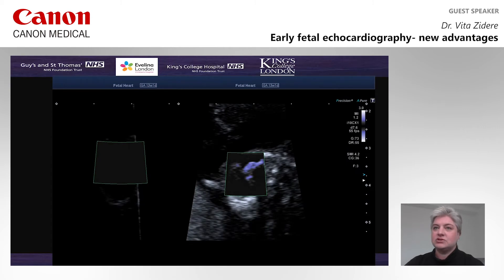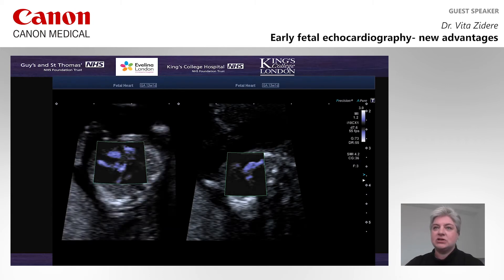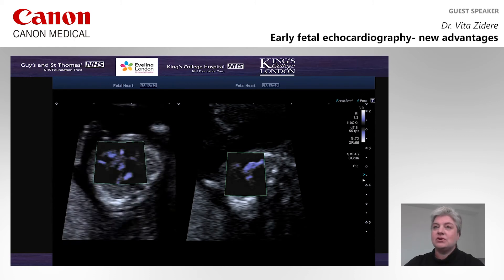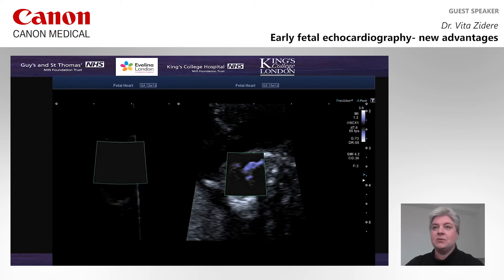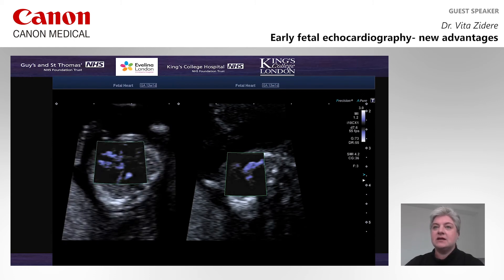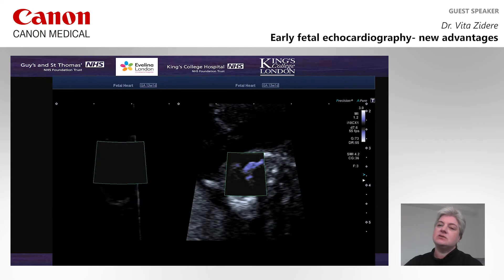We can now see the four-chamber view. Blood pool is highlighted within the ventricles and atriums. The interventricular septum is very well seen. We can also appreciate small vessels — pulmonary veins — returning back to the left atrium, which we were not able to see on previous images.